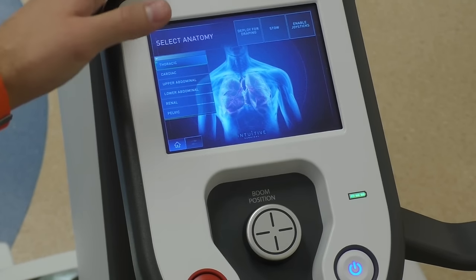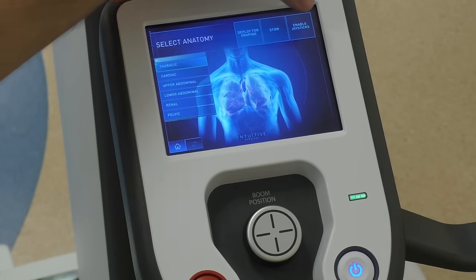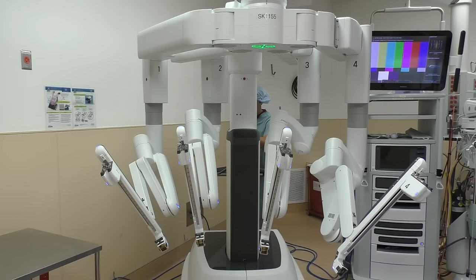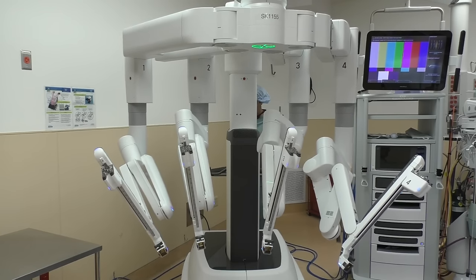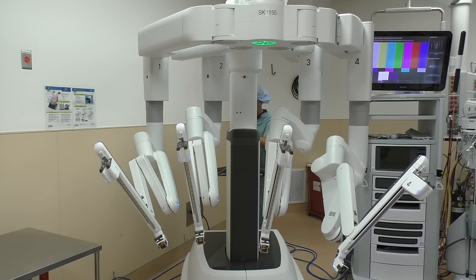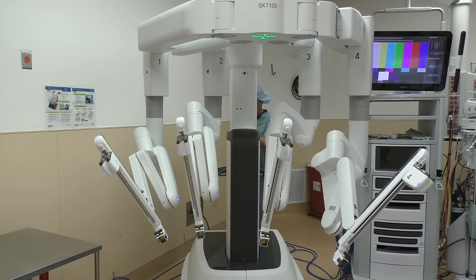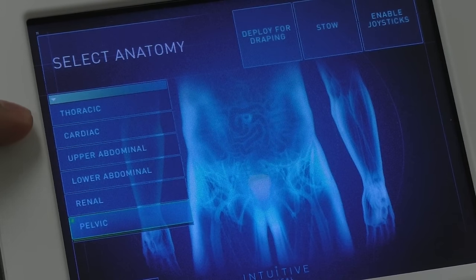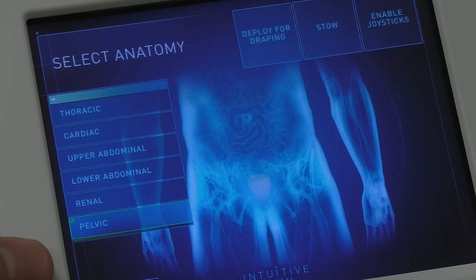Now if you are a nurse and you are going to be docking this, you can enable the joysticks specifically and you can control the boom itself by twisting the knob — going in and out, and increasing or lowering the boom height. You'll notice after we deployed for draping that a menu popped up on the left — this is kind of a specialty key.